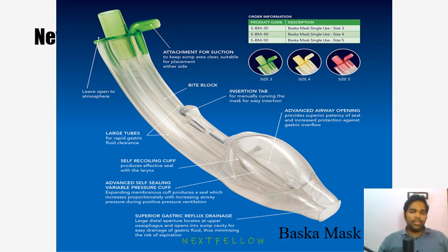It is actually produced in India and it is marketed as the best device. I have used it only once. Just remember, the head of this LMA, at some angle, may look like a snake. Baska means snake. So that is how you remember the Baska mask, and how you can easily identify it.